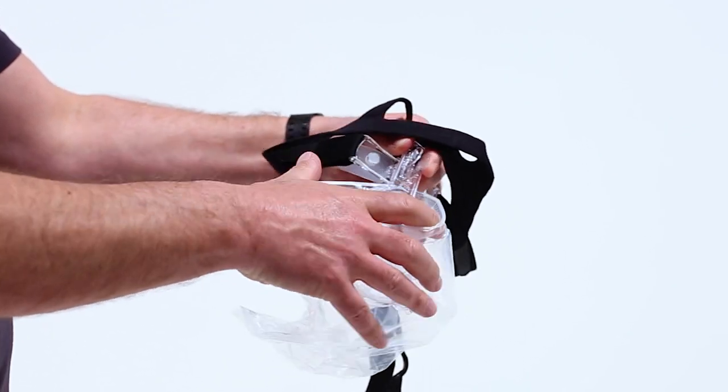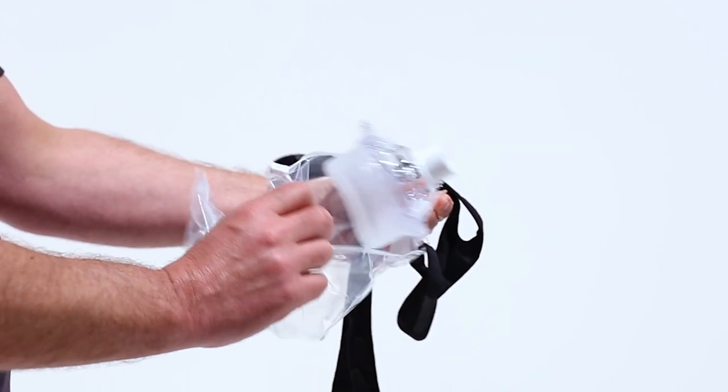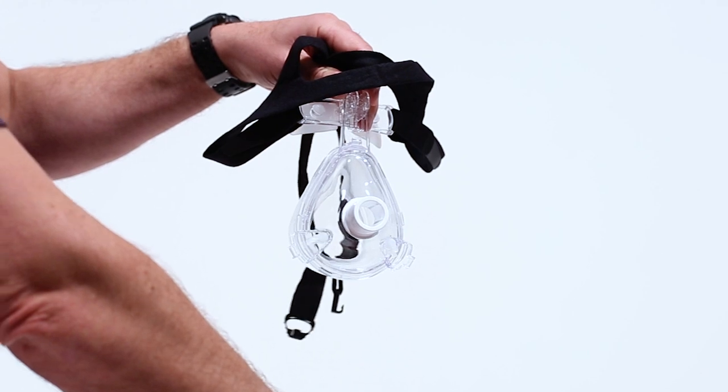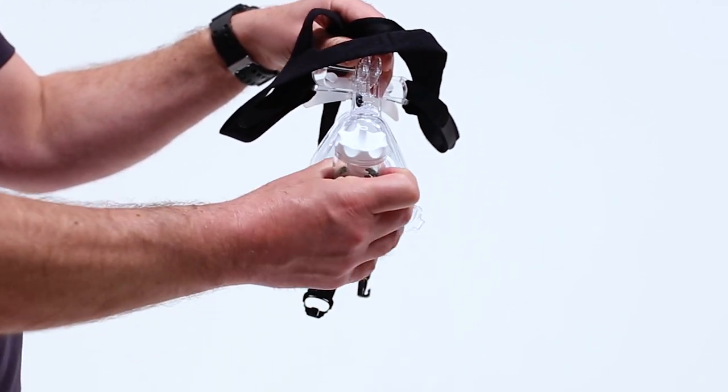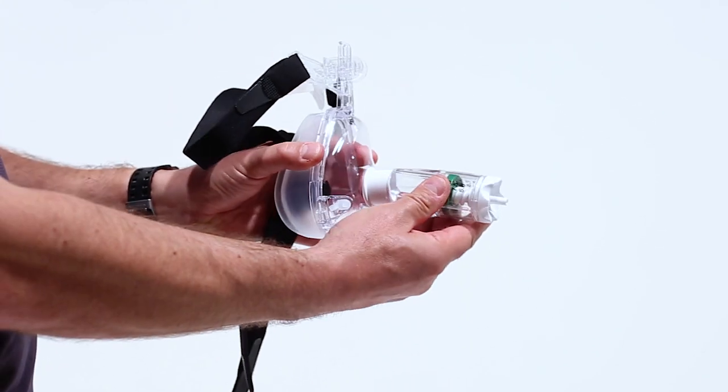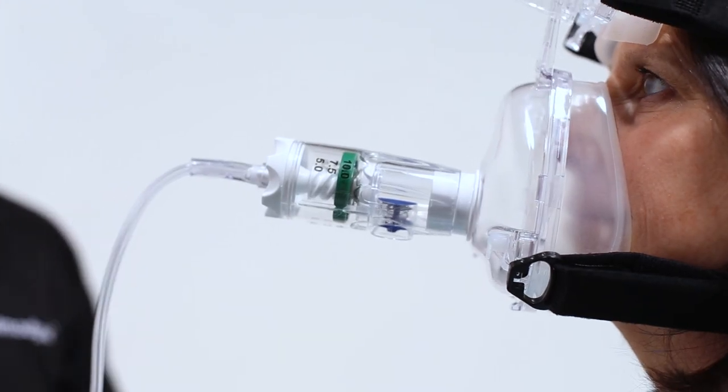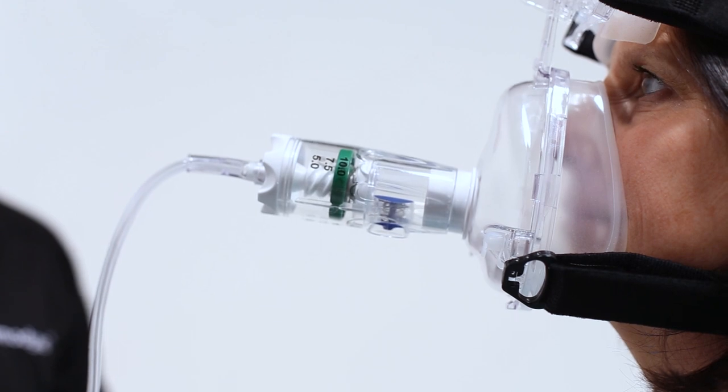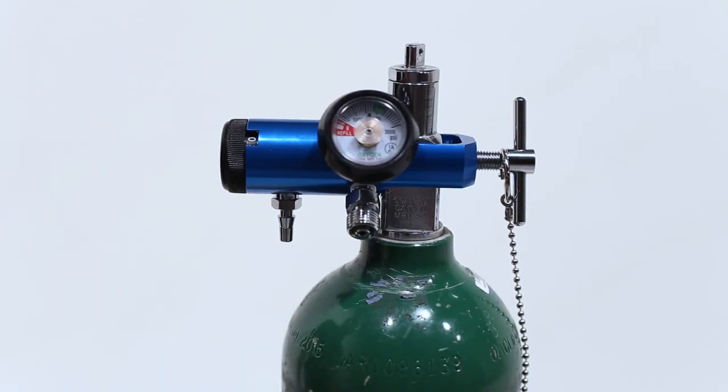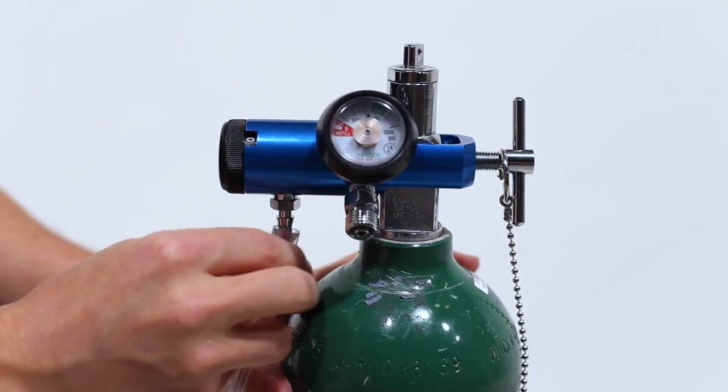The Bi-Track ED mask comes in its separate bag. Once you've taken the Bi-Track ED mask from the bag, the GO-PAP will fit on the hub of that mask. The end of your O2 tubing will fit onto the end of the GO-PAP. You will then need to connect your O2 tubing to the low-pressure port.